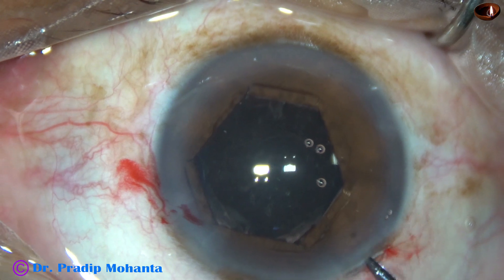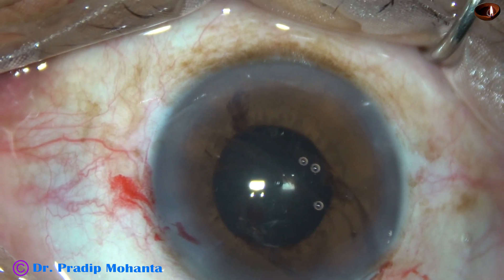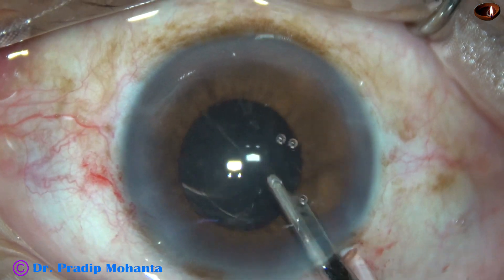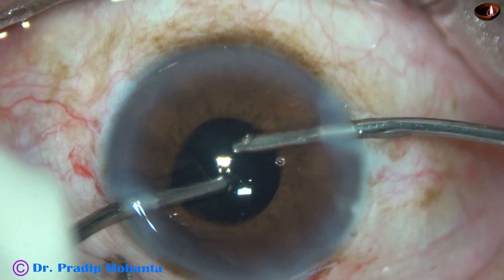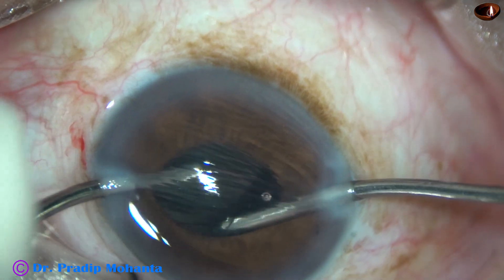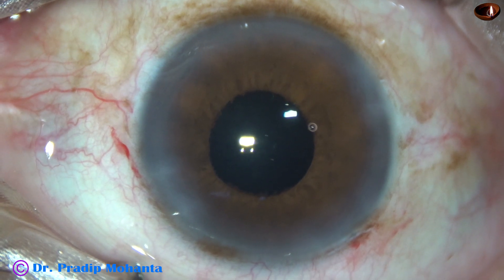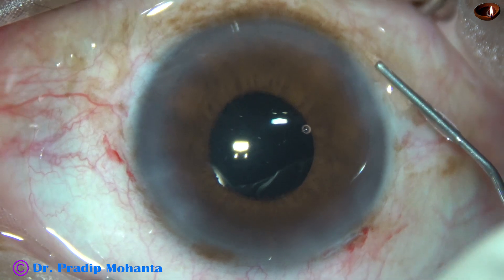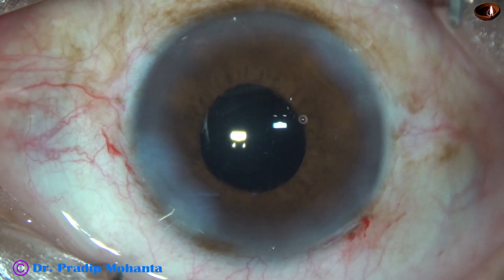I remove the Viscoelastic. Now it is time to remove the pupil expansion device. Any flange that is above the iris is held, all the flanges are untucked, and the expansion device is pulled out. Now thorough cleaning of Viscoelastic is done — first using a direct Simcoe cannula, then bimanual irrigation aspiration. All the Viscoelastic from the capsular bag is also removed. The pupil is round, and there is no damage to the sphincter by the device.